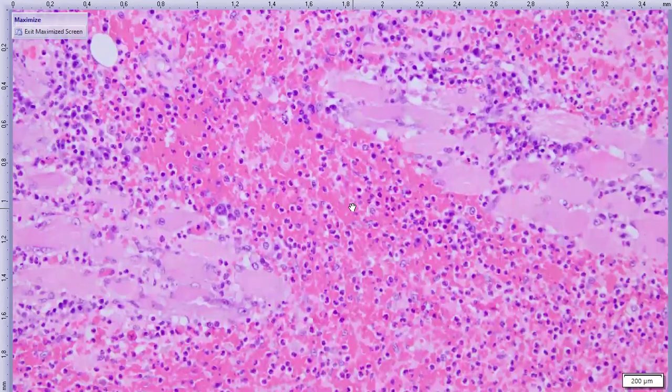Having pulled this case for rounds, I did dig through the remaining wet tissue really, really carefully to try and see if we were finding a worm anywhere. And sectioned in anything remotely curious looking, but I am doubtful that we'll find anything. And this case is still somewhat of a mystery at this point.